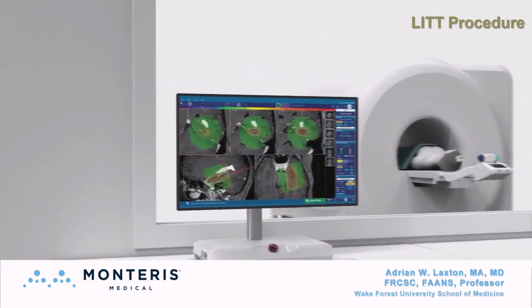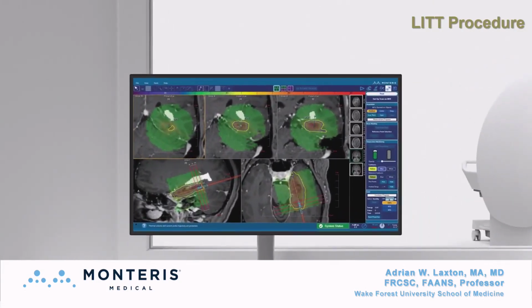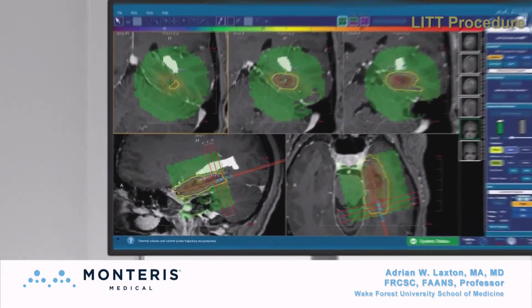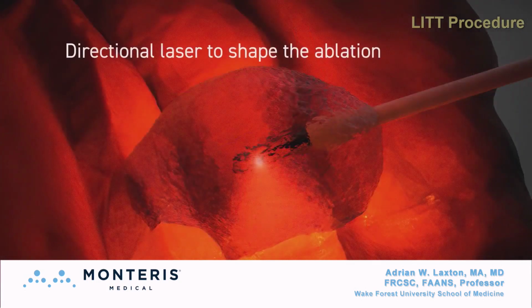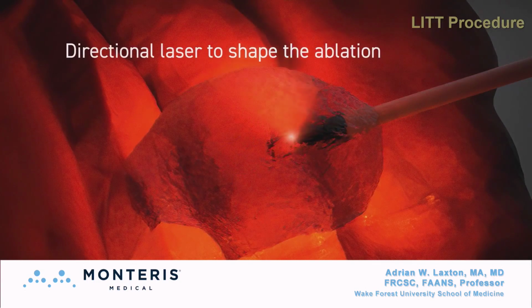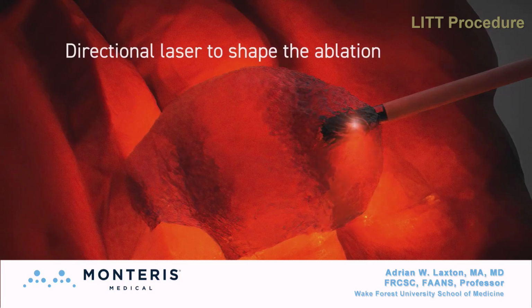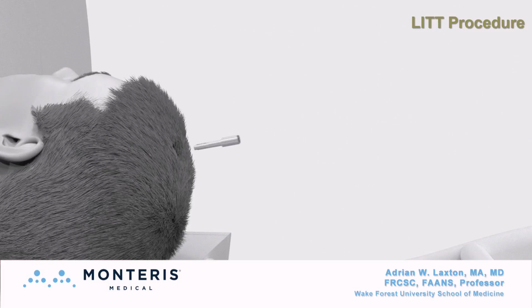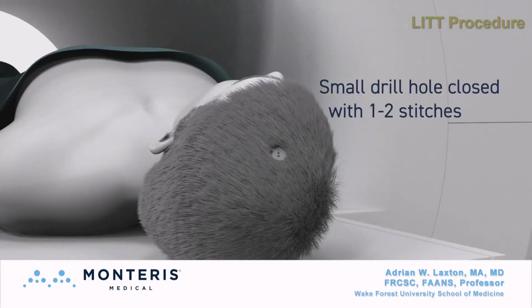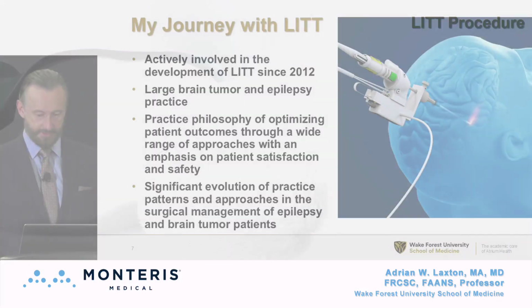And then we can see the NeuroBlate software. This appears to be an MTLE case here, an epilepsy case, but we're just getting an example of what in cartoon form the laser ablation looks like and ablating a lesion. This laser is able to heat tissue in a controlled way for a duration of time, which allows us to calculate how it's being ablated. And then, like I say, I close with 1 or 2 stitches.